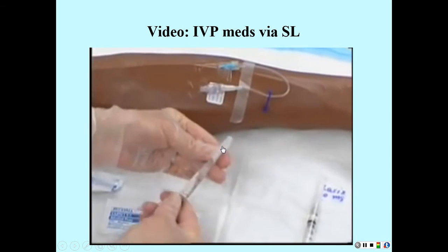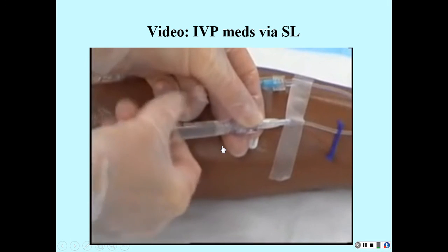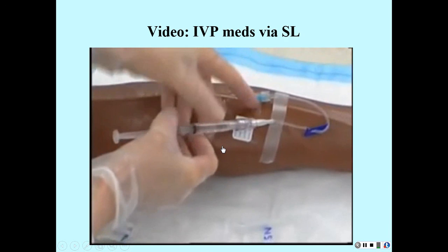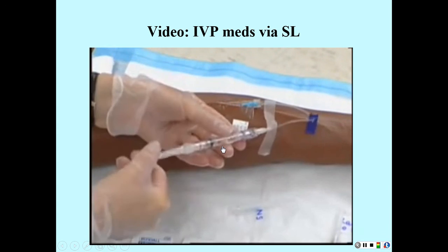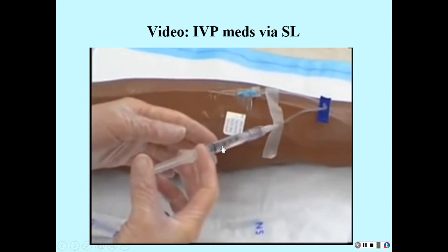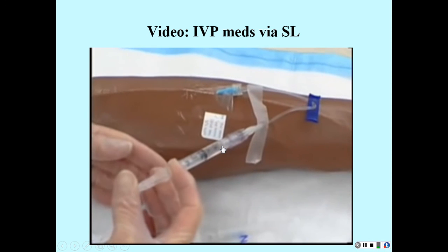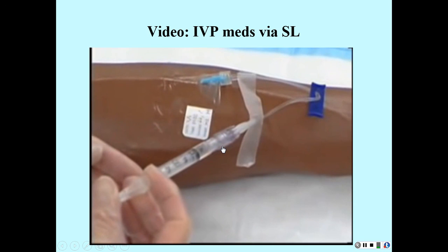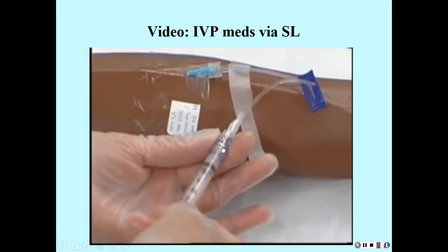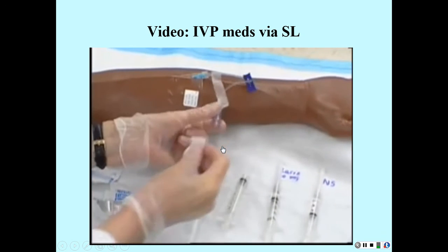Insert saline syringe into port. Open clamp if present. Briefly aspirate to check patency. Flush system and look for swelling or signs of discomfort. Insert medication syringe into port.